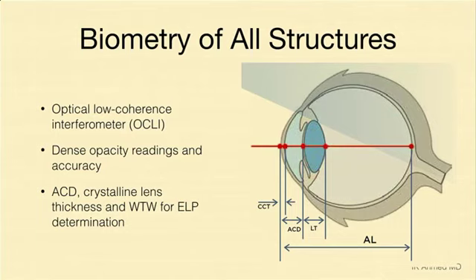One of the things, of course, that we look at is what structures are important to measure and where we are measuring. I think we're at the point now where using 2 variable formulas is outdated. If you look at some of the recent publications, the really good publication by the Melles group in Ophthalmology 2018, it clearly shows the value of using a multi-variable formula compared to 2 variable formulas for all axial lengths. If every patient you do is a 23 millimeter eye with an average 43 K, an average AC depth and lens thickness, you're probably going to be fine using Holladay 1, SRK, classical formulas.